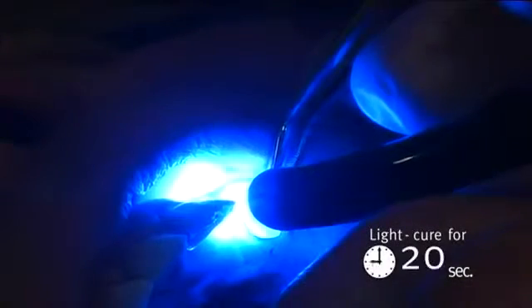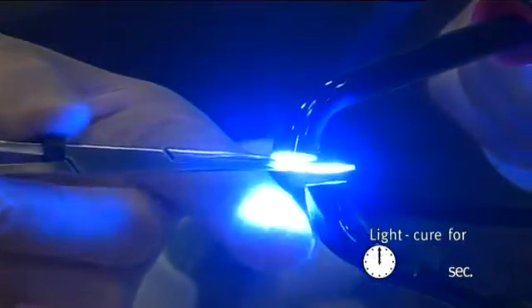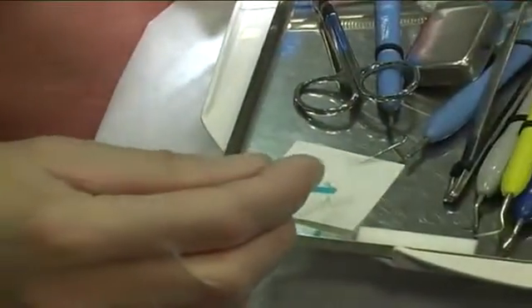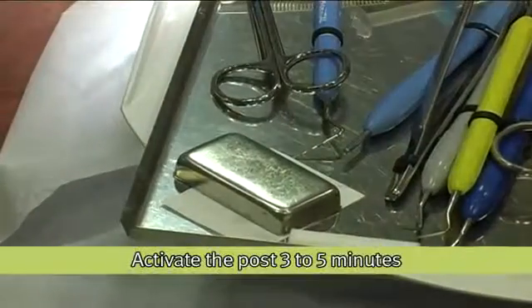The shaped post was light cured for 20 seconds inside the canal. The post was then removed from the canal and light cured on all sides for 40 seconds. A layer of enamel resin was applied onto the post's surface to activate the IPN feature. The post was then covered from light until it is cemented.